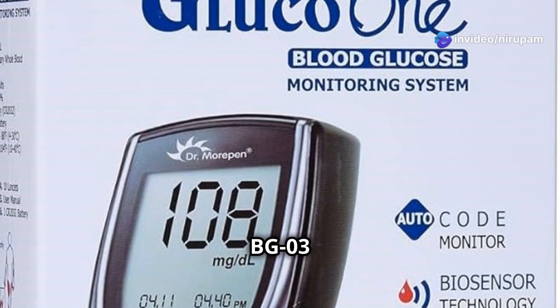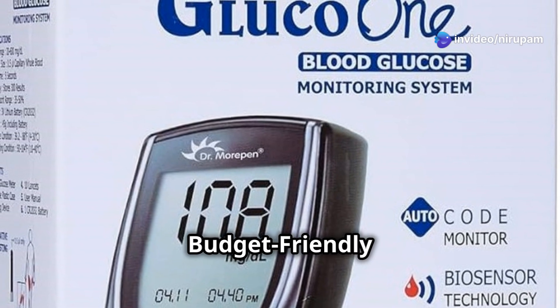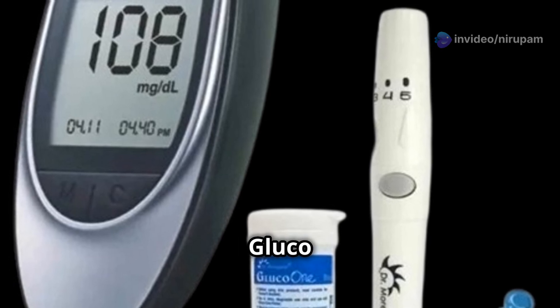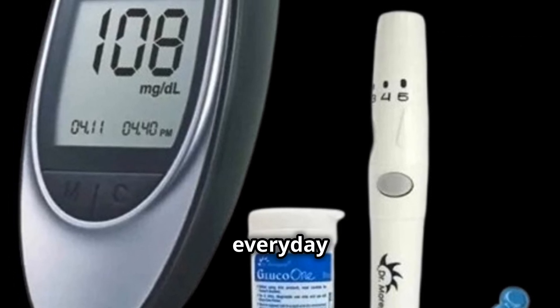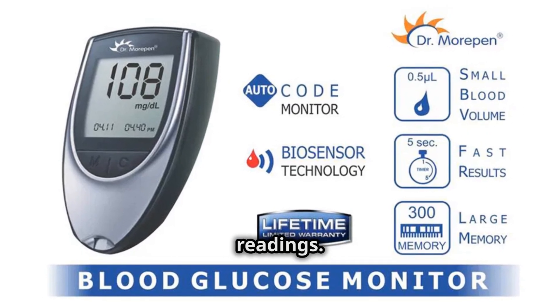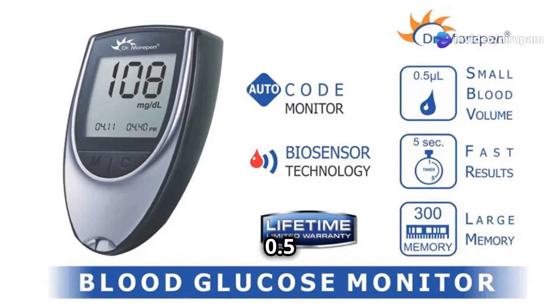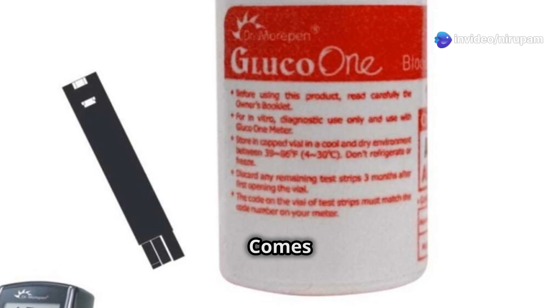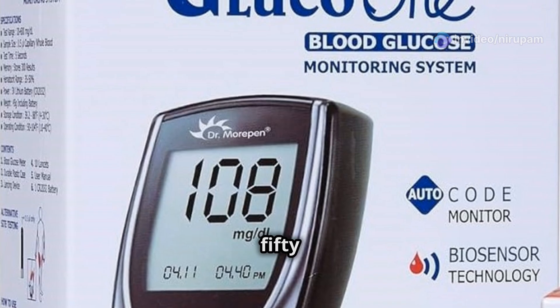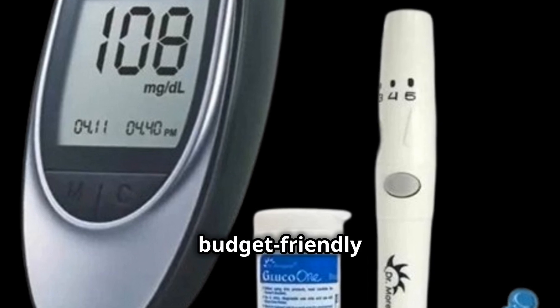Dr. Morpen BG03 Gluco One — Best Budget-Friendly Option. Affordable and reliable, the Dr. Morpen BG03 Gluco One is perfect for everyday use. Quick results in just 5 seconds, stores up to 300 readings, and needs only a tiny 0.5 microliter blood sample. Comes with 10 lancets and 50 test strips, all for around 450 rupees. A solid, budget-friendly choice.